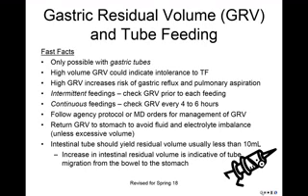Gastric residual volume is checked with tube feeding administration to assess tube feeding tolerance. Remember that gastric residual volume, or GRV for short, refers to the volume of fluid remaining in the stomach at a point in time during the enteral feeding. Nurses withdraw GRV from the feeding tube with a 60 milliliter syringe, usually every 4 to 6 hours. Checking GRV is only possible with tubes that are in the stomach. It is not possible with intestinal tubes.